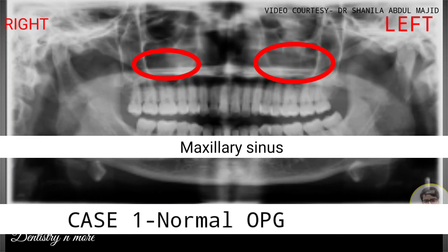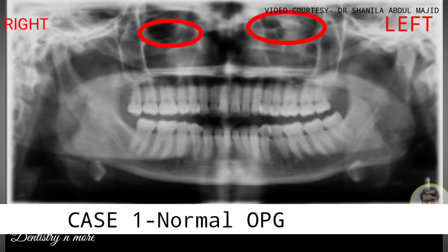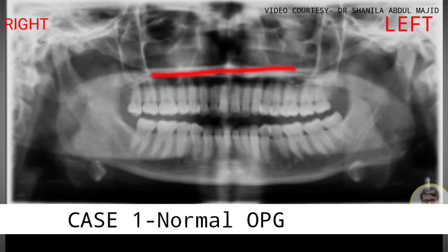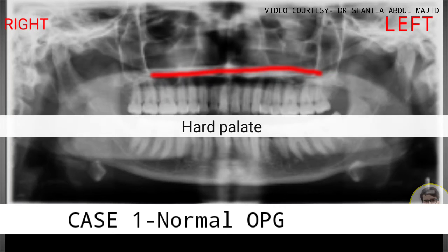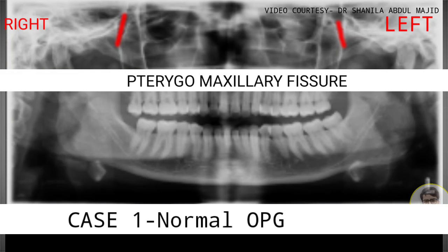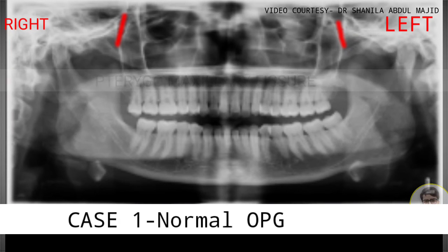Then we move on to the maxilla. In the maxilla we have the maxillary sinus, then the floor of the maxillary sinus, and above the maxillary sinus is the orbit — you see the floor of the orbit. You can also see a radiopaque outline seen bilaterally, which is the hard palate. You might also see the pterygomaxillary fissure, which is visible in this case.